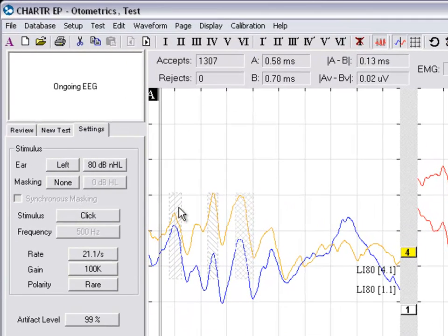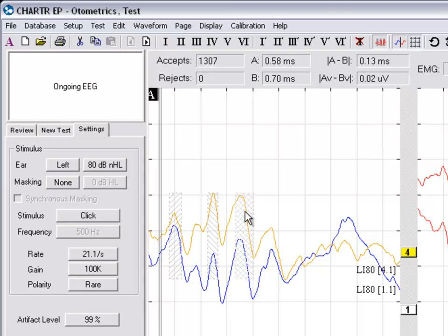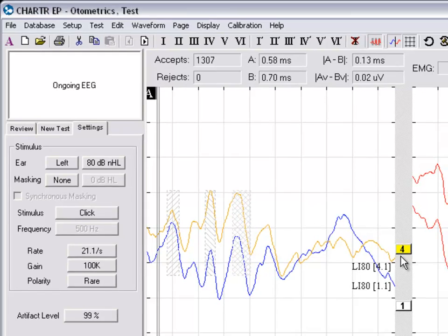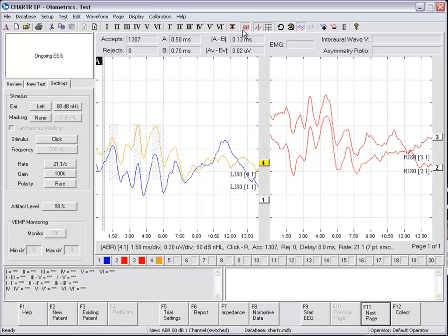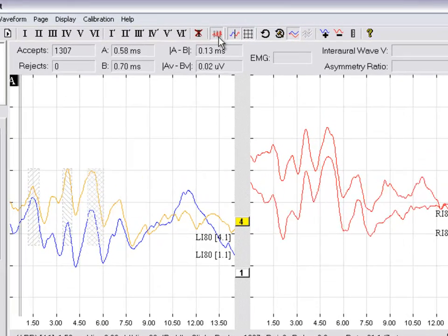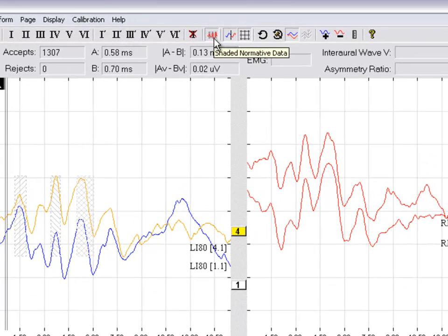Again, it will place hashed areas on the waveform. You can turn this feature on and off by using the icon on the menu bar.